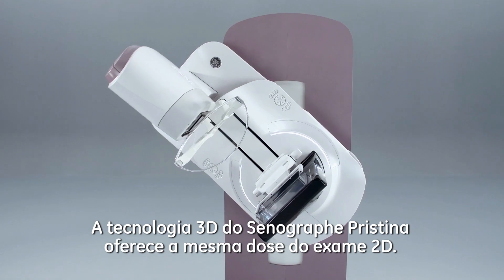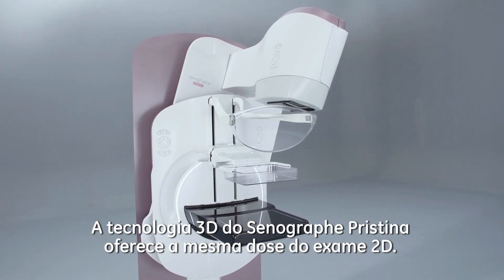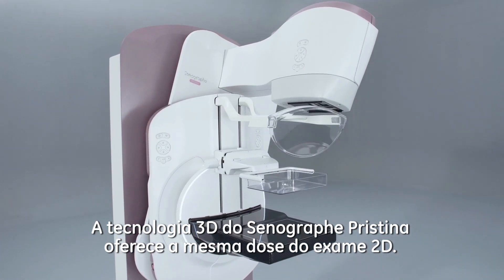SeneGraph Pristina features 3D technology that delivers the same dose as a 2D exam.